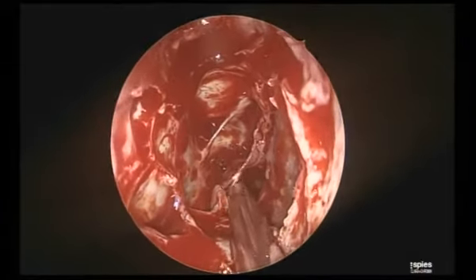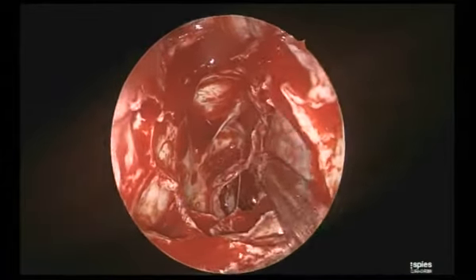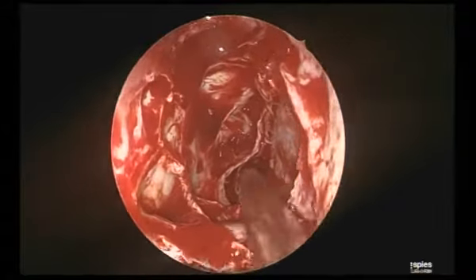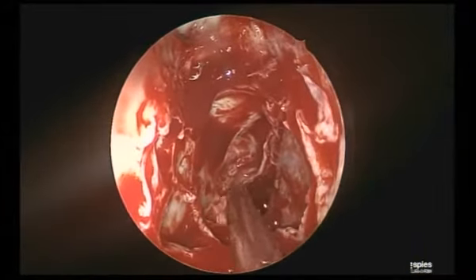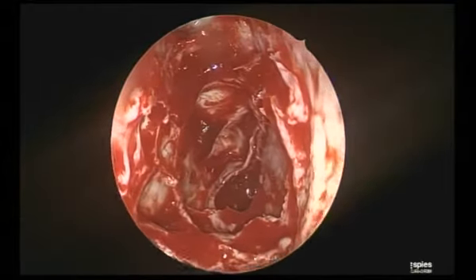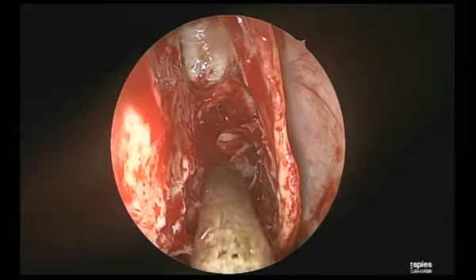See, sometimes if you widen too much inferiorly, what can happen? You can see the septal branch. See, that is because of the more inferior widening. Sometimes it is very close to the ostium, sometimes far off. So you do not need to bother about it. This used to create a panic in us before.